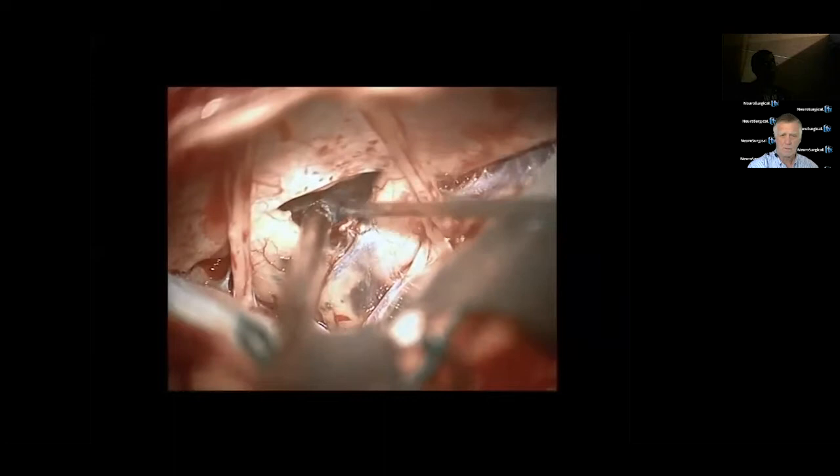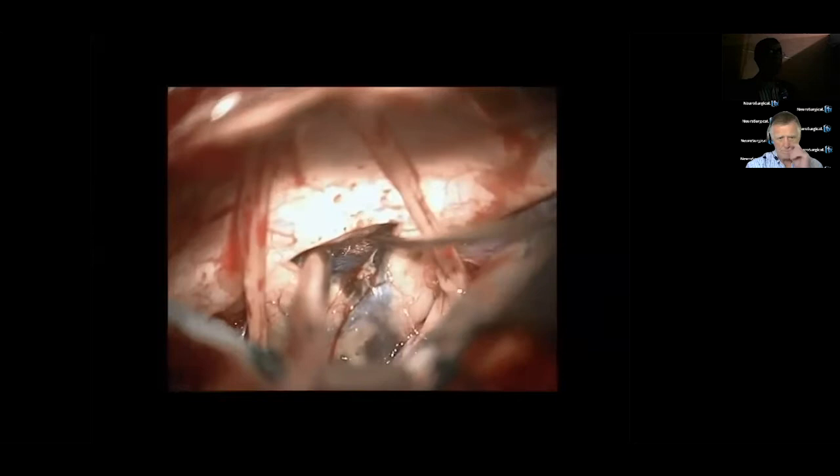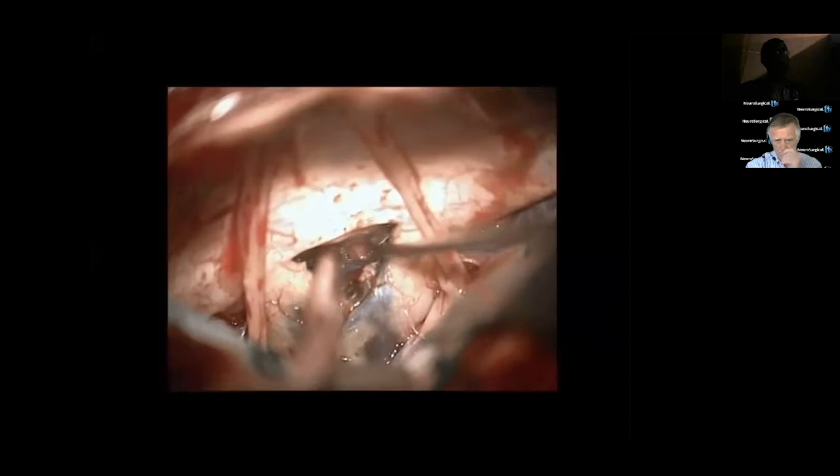Now you have to stop and think, what should you do? Now you tackle this. But I am prepared, just in case it was an aneurysm, that aneurysm clips are ready, mounted on the table. If I don't know the differential diagnosis, I would not be prepared. You were saying that it's well circumscribed, right? Yes, it is well circumscribed, but it is in the chiasm. So you have to dissect it off the chiasm, and that's the risk, with these tiny little vessels that we mentioned.